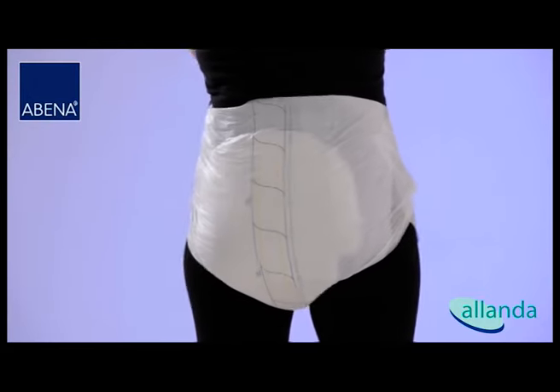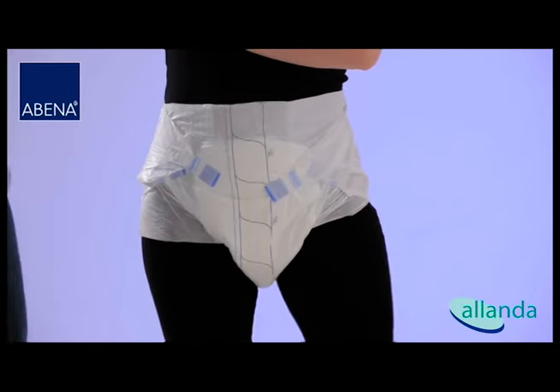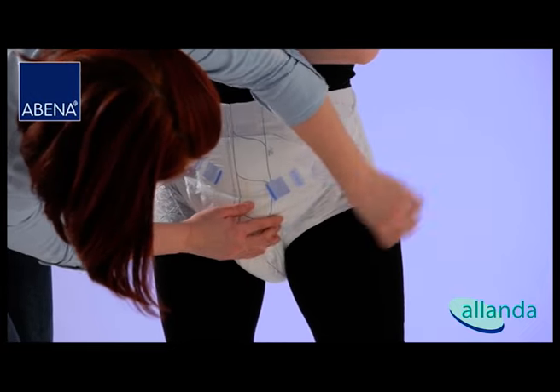The product fits correctly if the wetness indicator is parallel to the perineum. Check the edges for a proper fit.